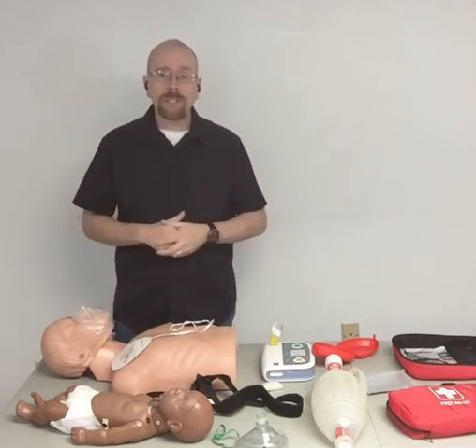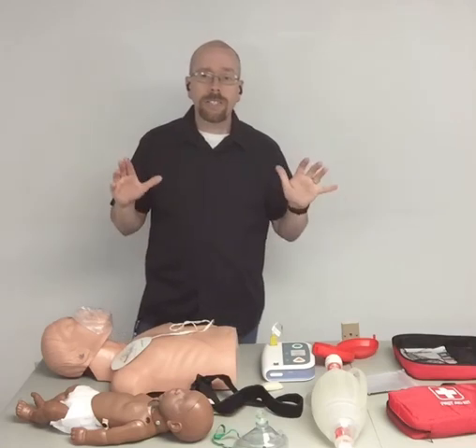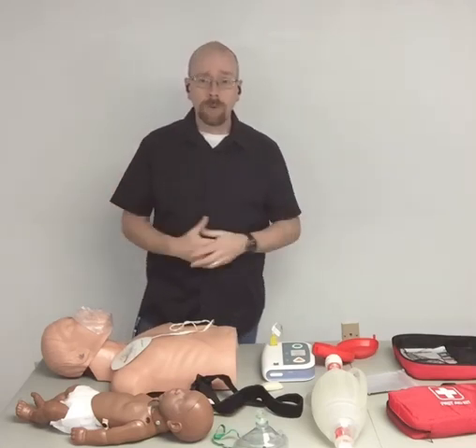That's the true story about the defib. It doesn't jump start the heart. It actually temporarily stops the heart to convert that abnormal rhythm.